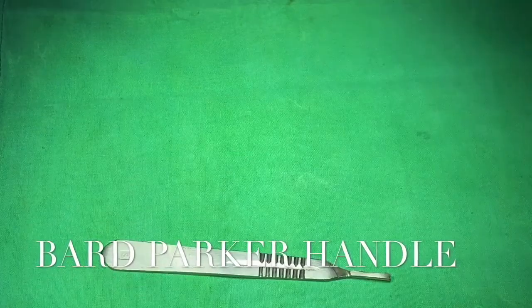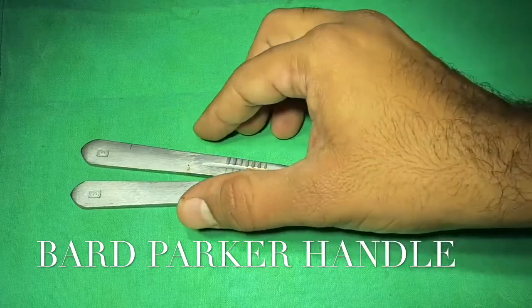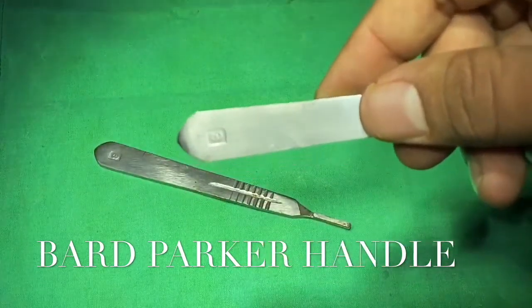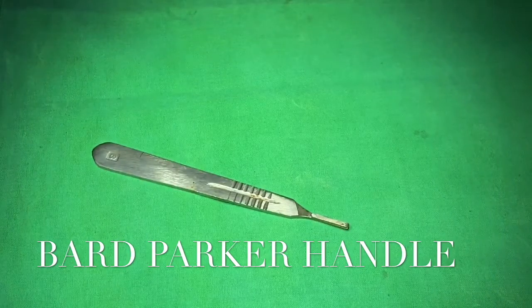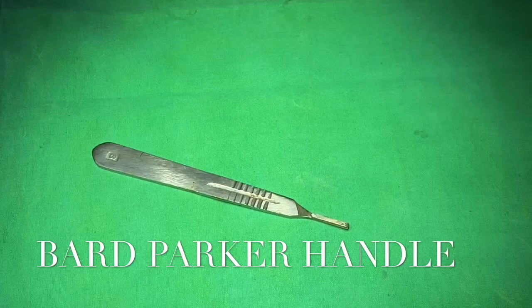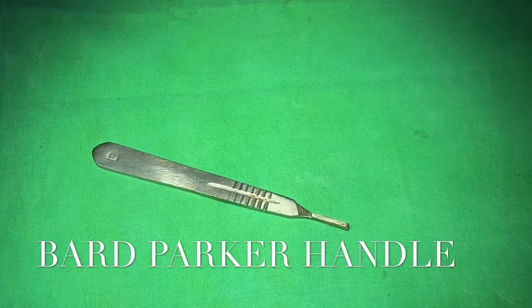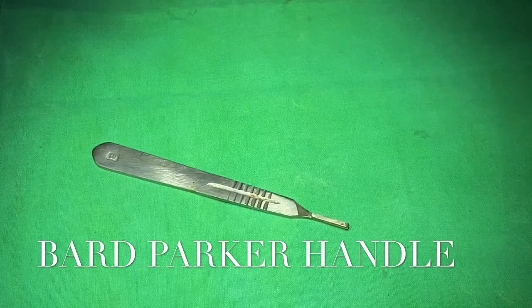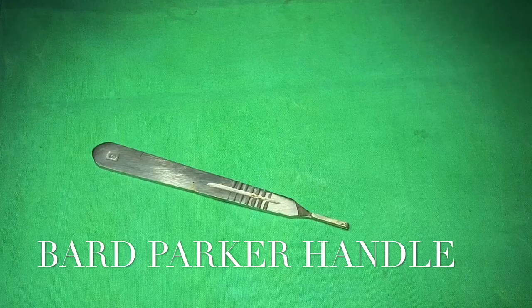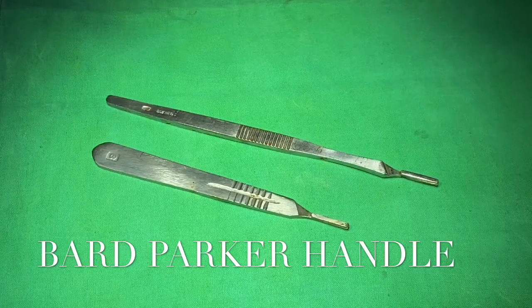These are Bard-Parker handles of different numbers. Handle numbers 3 and 7 suit blades with the prefix 1 — for example, blades 10, 11, 12, and 15. BP handle number 4 suits blades with the prefix 2 — such as blades 20, 21, and 22. The difference between BP handle number 3 and number 7 is only the length; the number 7 handle is much longer than number 3.